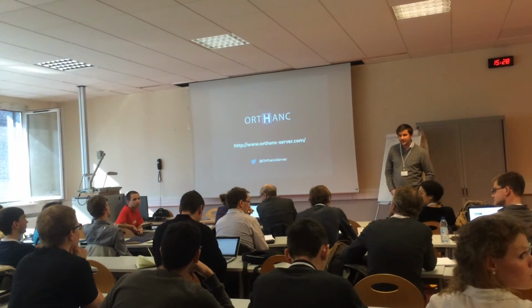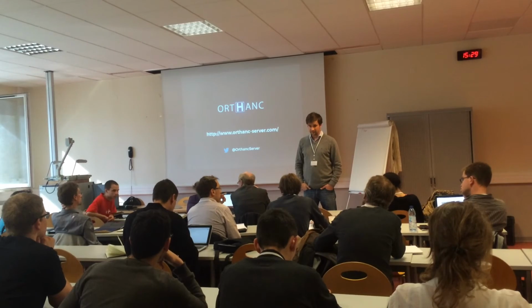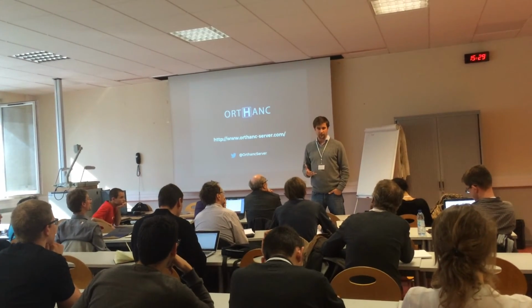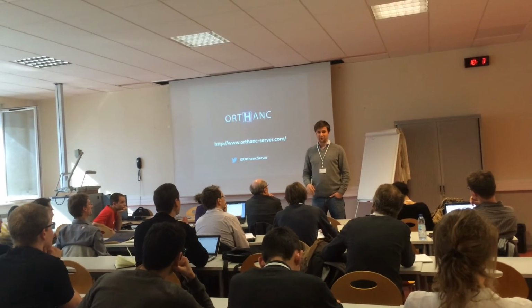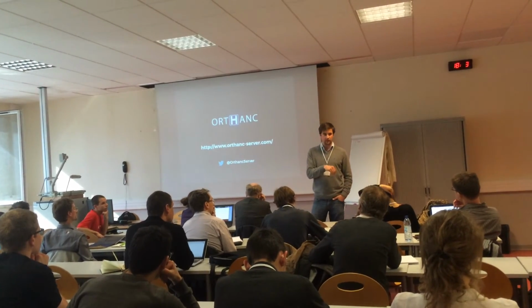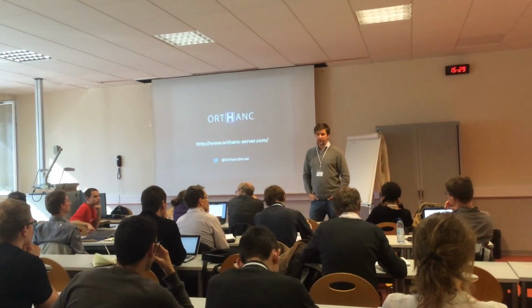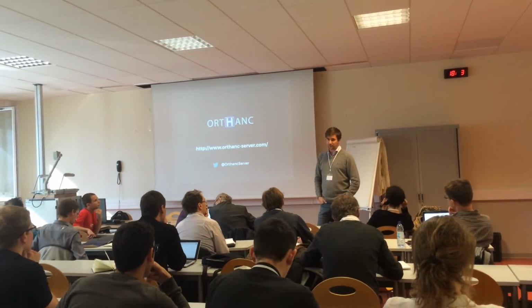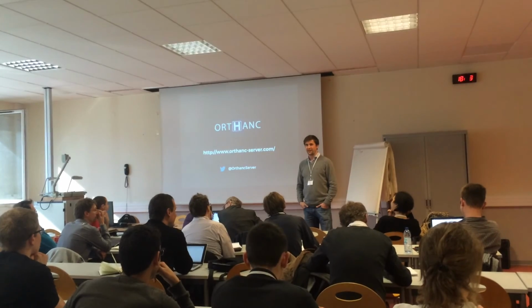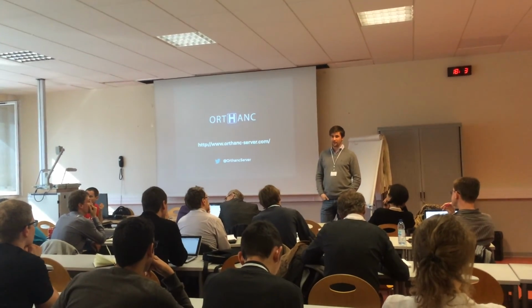I had a question about Orthanc being presented in the cloud. I think this is not in France. It is in France, actually, but when we say cloud, that can be a private cloud. That can be just a server somewhere in a cluster of hospitals, which is managed by the same group of hospitals. So whether they'll be storing it on their server in one hospital or on a centralized server is the same thing. But I know it's an issue in France, and we're still trying to figure out how we can solve that. We're actually thinking of becoming ISO 27001 certified, so we're granted the right to store medical data.